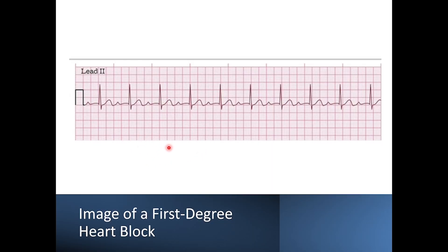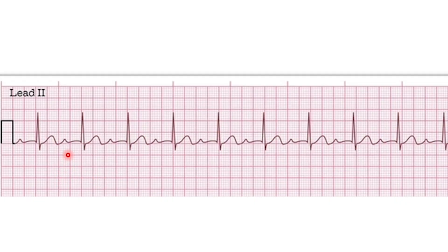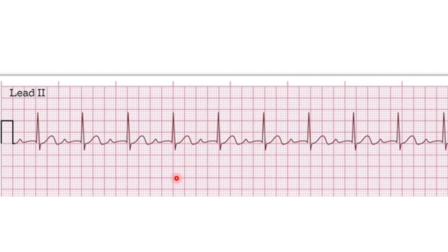Here we can see an example of a first-degree heart block. We want to identify the PR interval — we can see that the P wave matches up at the beginning of the PR interval, and it takes more than one big red box, almost like one and a half, so about 0.32 seconds for this PR interval. That breaks rule two, where the PR interval should not be greater than 0.2 seconds. There's one P wave for every QRS complex, the P waves match with the P waves, and the QRS complexes match — it's just rule two that is broken.